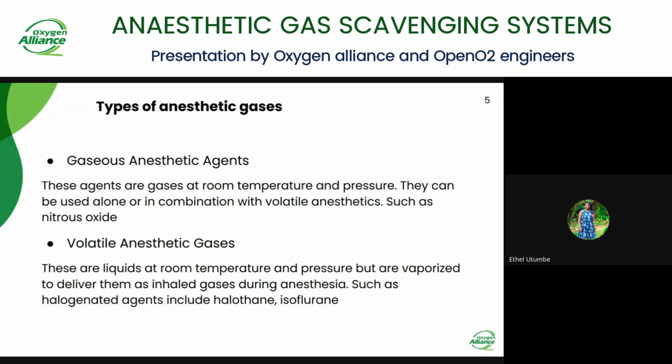These are liquids at room temperature and pressure, but can be vaporized to deliver them as inhaled gases during the anesthesia. Like I've already said, the nitrous oxide can be combined with the volatile anesthetics in the anesthesia machine. Sometimes the nitrous oxide cannot be used alone.